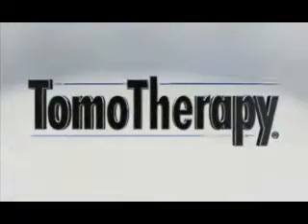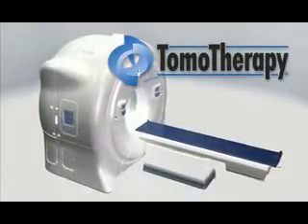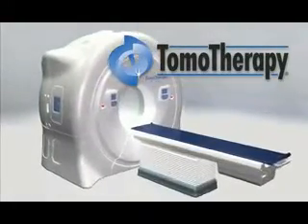I'm Rock Mackey, co-founder of TomoTherapy. I will walk you through the steps in a typical TomoTherapy treatment session and present a few sample cases.